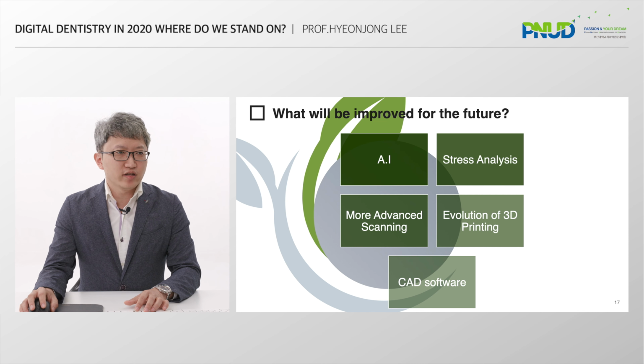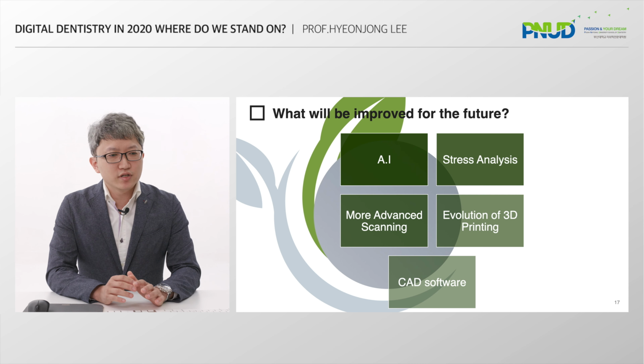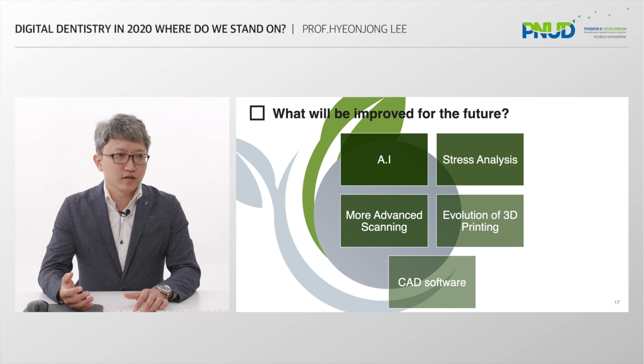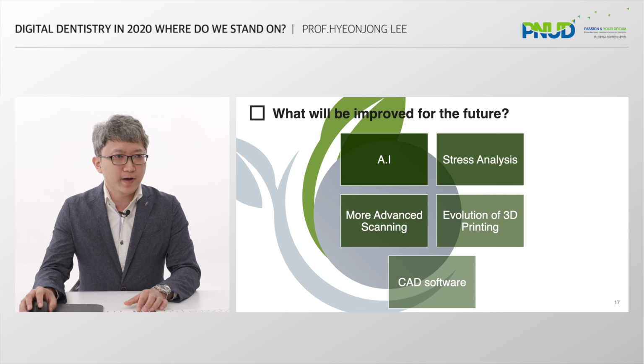And stress analysis, the so-called finite element analysis, has been conducted only for research purposes. But I guess after 4 or 5 years, a common dentist would be able to analyze stress a bit in CAD software, I hope and I guess.